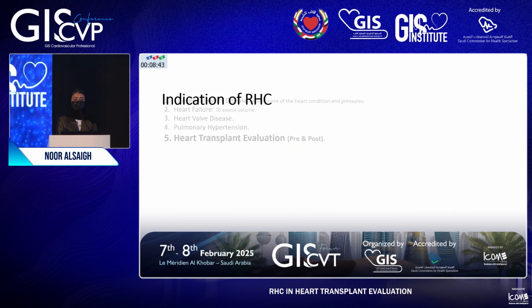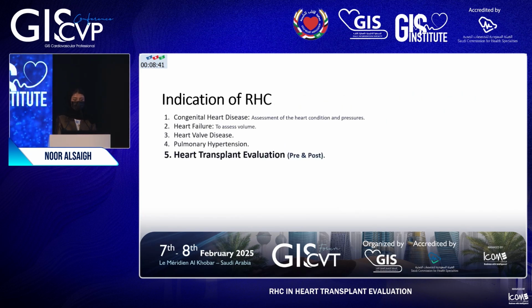It's indicated for patients with congenital heart disease to assess their heart condition and pressure, patients with heart failure to assess their volume and to optimize their medication, patients who have heart valve disease, pulmonary hypertension, and patients who will go for heart transplant, before and after. We're going to discuss this in detail later.